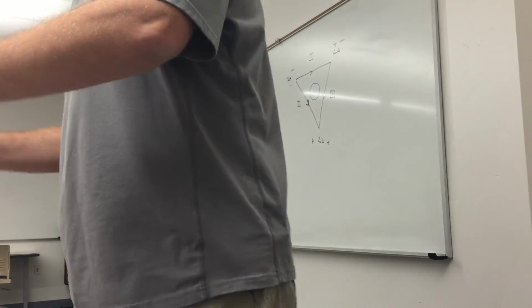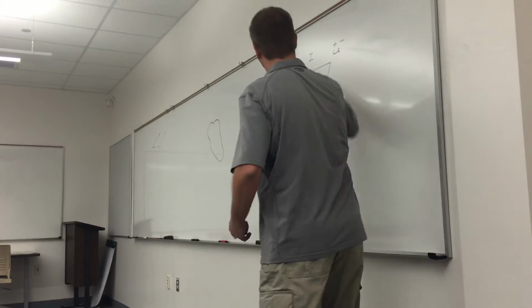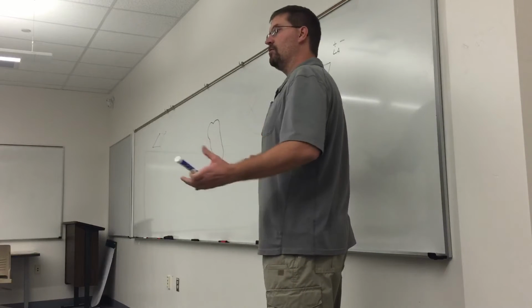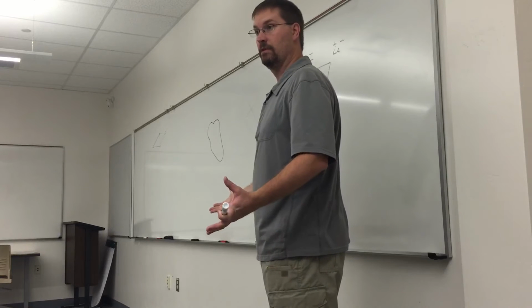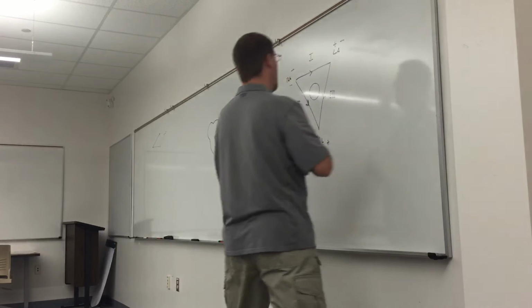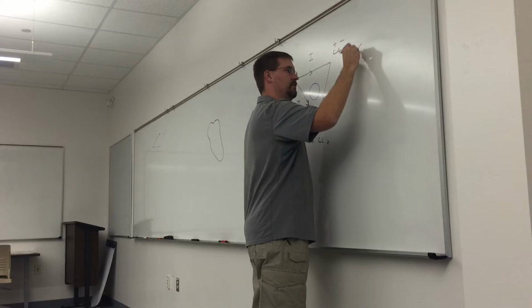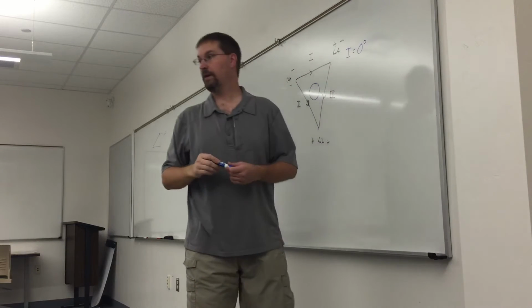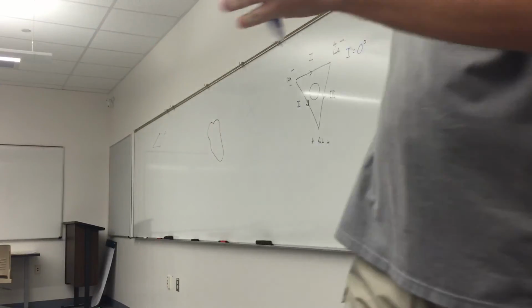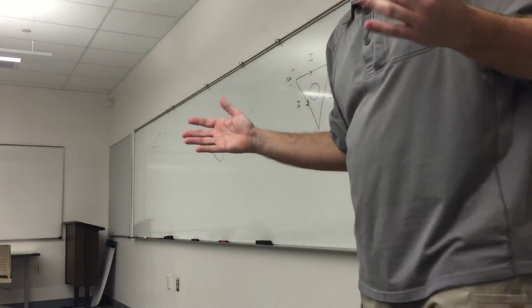I'm going to assign a value to lead 1. Because we're talking about a sphere or circle around the heart, it makes sense to talk in degrees, because you're going around a circle, right? So why not start at lead 1, and let's just call lead 1 0 degrees. You guys cool with that? We're just going to start there. We're going to say lead 1 is 0 degrees, right along that lead. So far, so good?